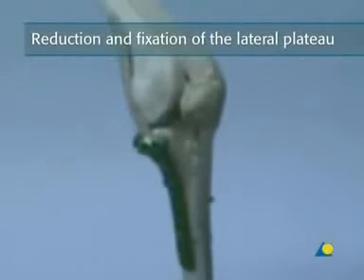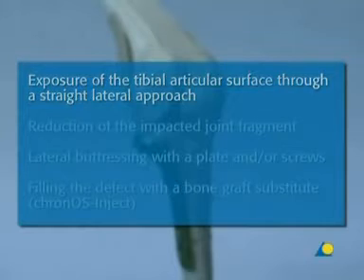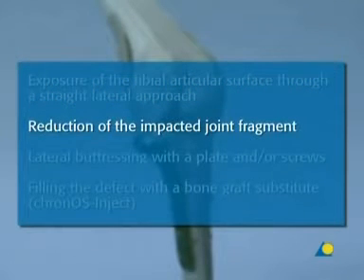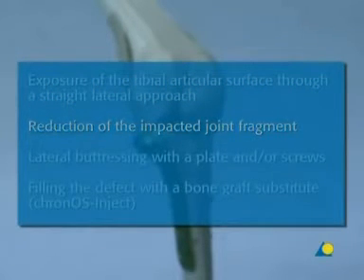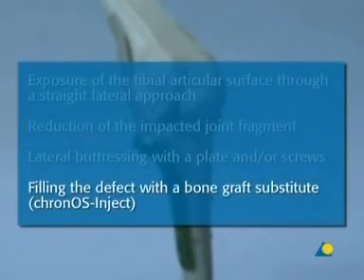Reconstruction of the lateral plateau. First, exposure of the tibial articular surface through a straight lateral approach. Second, reduction of the impacted joint fragment. Third, lateral buttressing with a plate and screws. Fourth, filling the defect with a bone graft substitute, Chronos Inject.